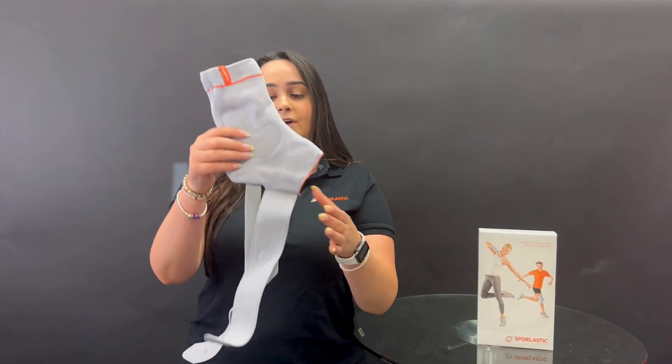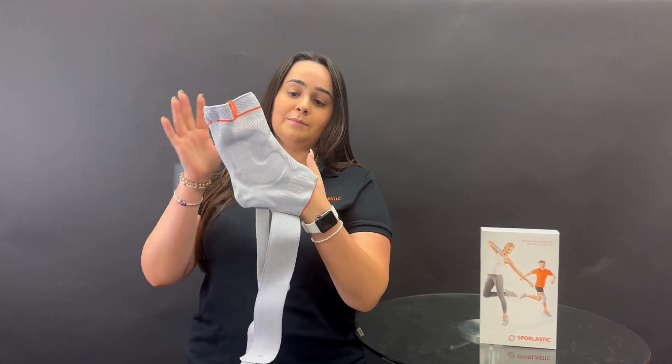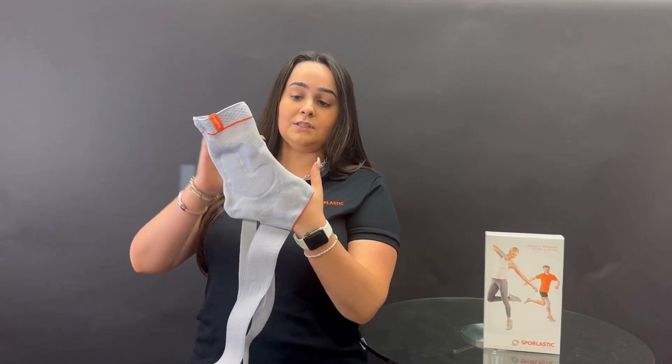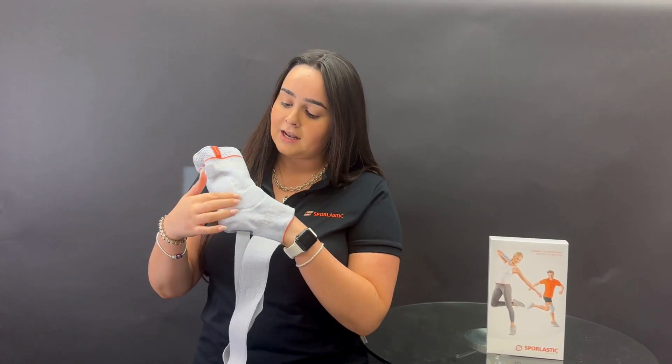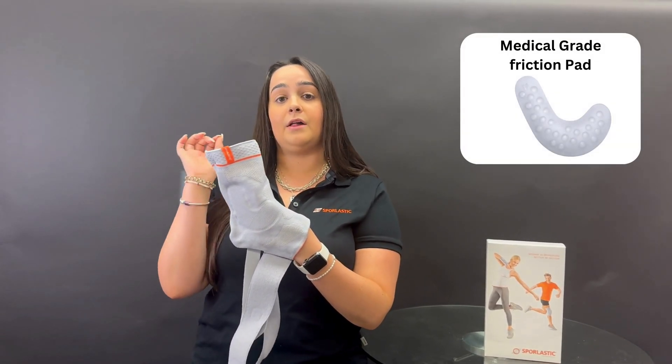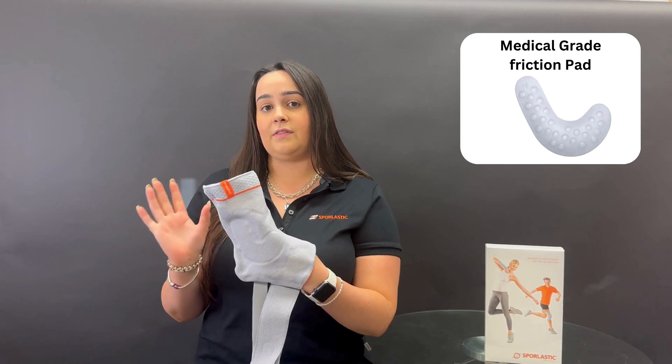I've undone all the straps on the brace so you can see that underneath all those straps there is an ankle support — it's a compression-based sleeve with medical grade silicone that wraps right around the malleoli to provide a massaging effect as well as some support in that region.